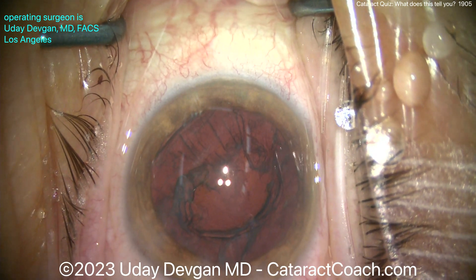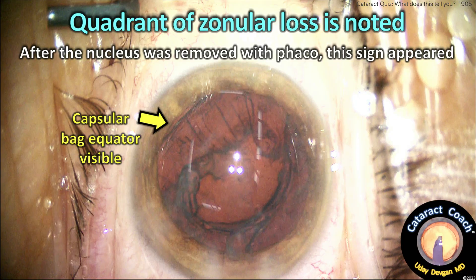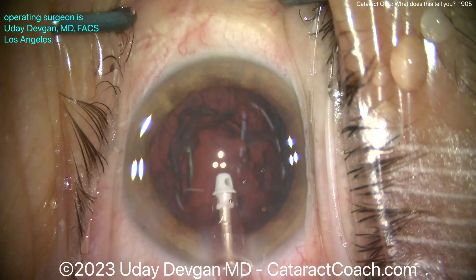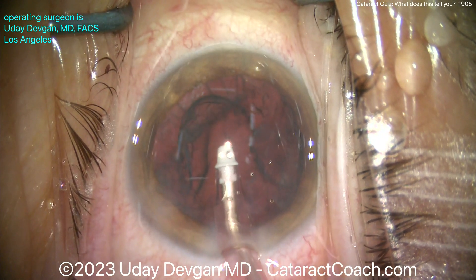I noticed this immediately after it came out of the eye: that's the capsular bag equator, and it's visible. That means that quadrant has no zonular support. That's a big deal, and that needs to be recognized any time you see it. So I'll go in now with the I/A probe and let's do the cortex removal.